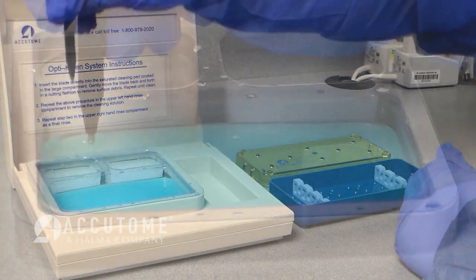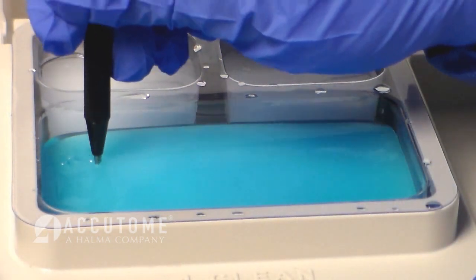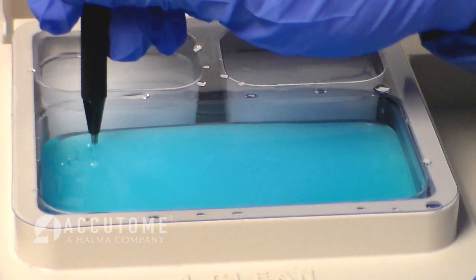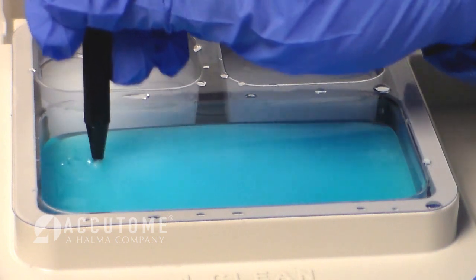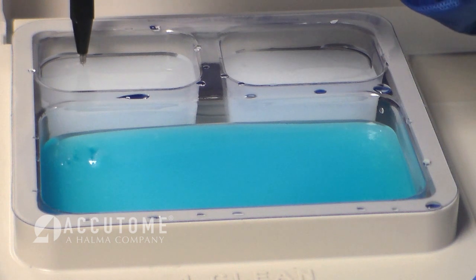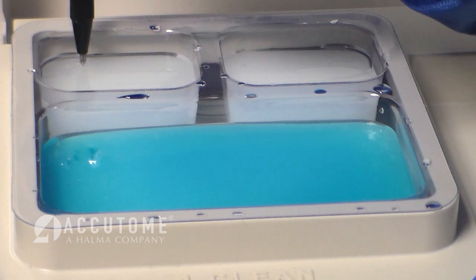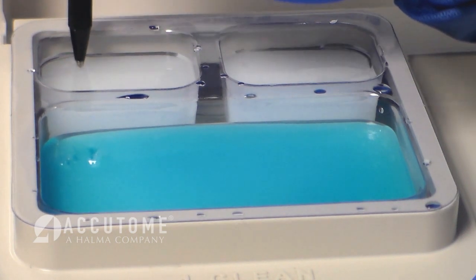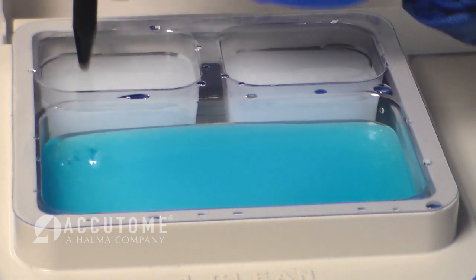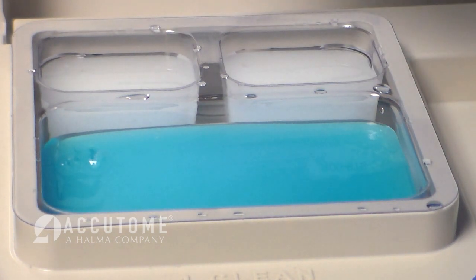Work the blade in a cutting-like fashion and allow the gentle scrubbing to clean and remove debris off the blade surface and deposit it into the pad. This system utilizes a soft foam-like material impregnated with OptiClean cleaning detergent that loosens proteins and other deposits. Simply repeat this in two separate rinsing compartments. The white compartments contain USP grade filtered rinse water.